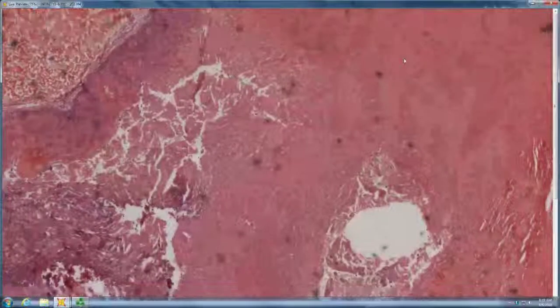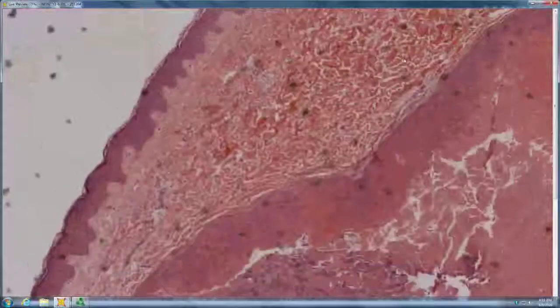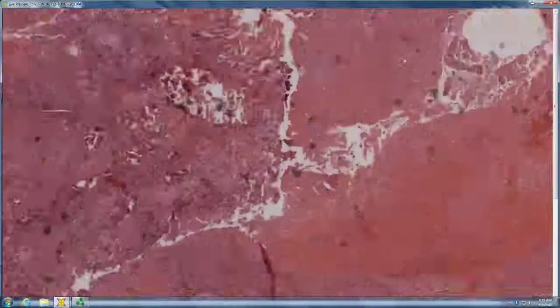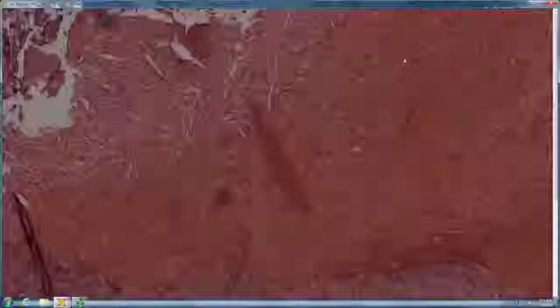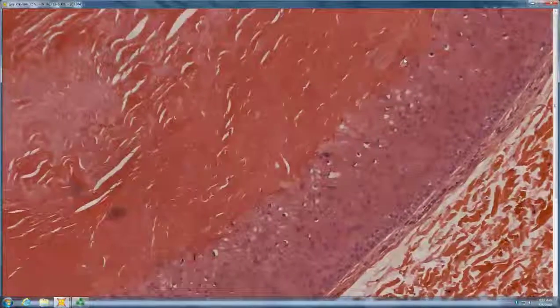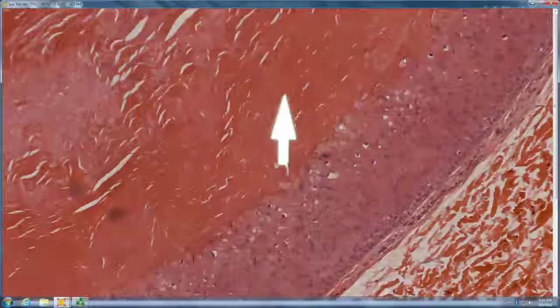I see a cyst-like structure. Yep. Do you see basaloid cells? Or is it all kind of pink and then undergoing abrupt keratinization? The pilar cyst.